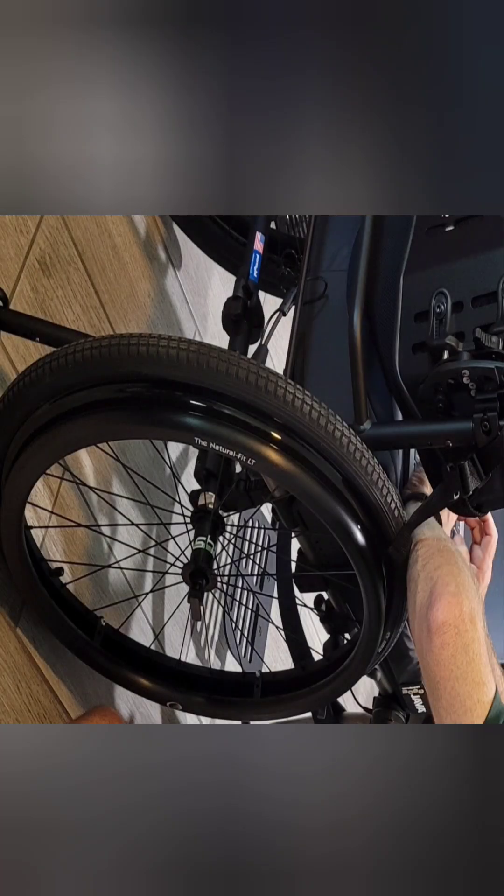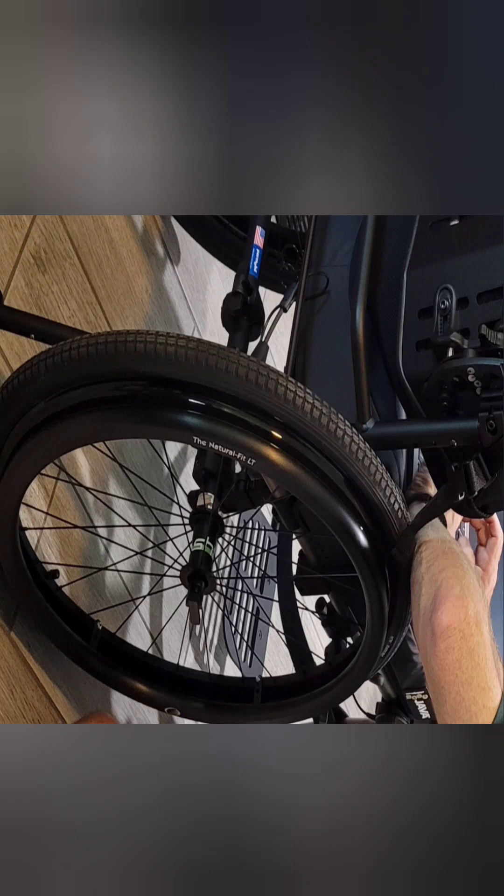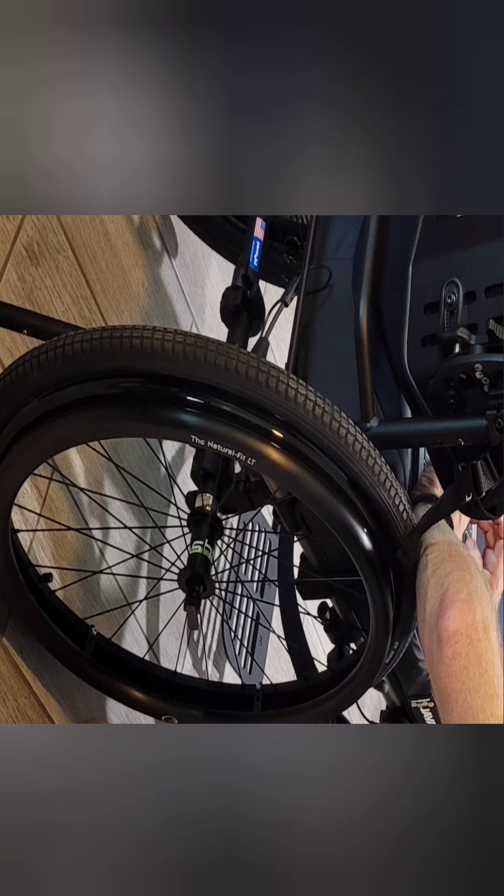This is my daily driver, the one I like to keep in my car. I disassemble it, get it in the car with me, take it out and reassemble it, and go on about whatever I'm doing. This was the first day I got it — the ATP is here making some adjustments, and it doesn't look like that anymore. The push handles are different now, the backrest is different now, the wheels and push rims are different, and I don't run the wheelie bars anymore. You make adjustments and fit it to what's best for you.